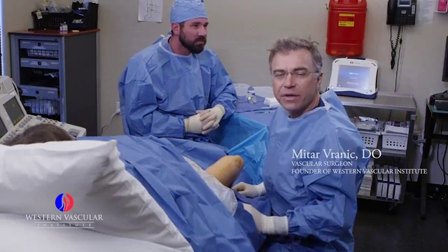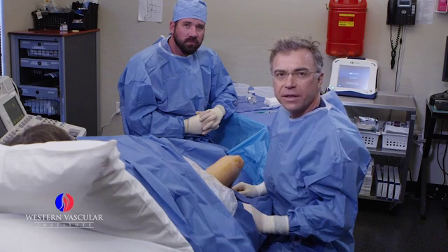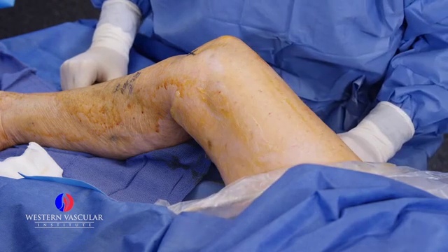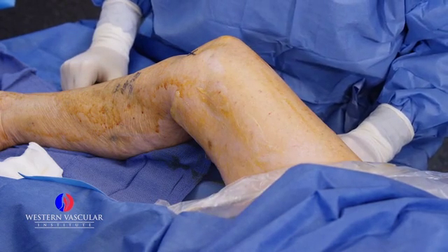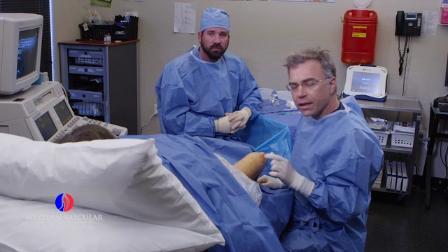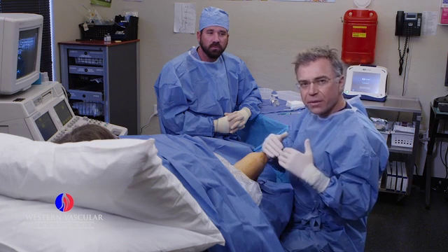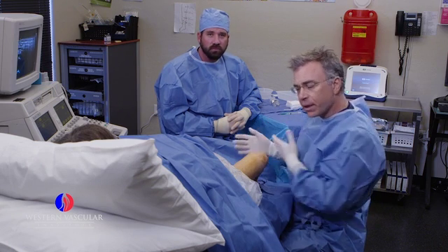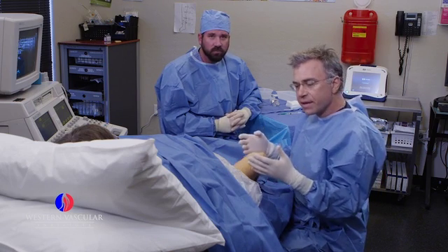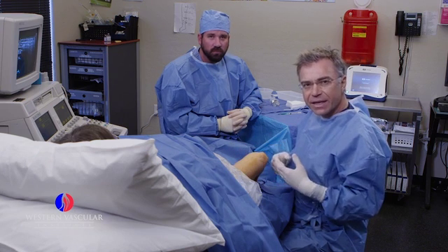This is a patient we're treating today with venous insufficiency and varicose veins. Based on the ultrasound we did earlier, we determined that she has very dilated varicose veins and saphenous vein on the inner aspect of the thigh. The vein is not functional, and when she stands, a lot of pooling is occurring in the lower aspect with leg symptoms such as achiness and throbbing.